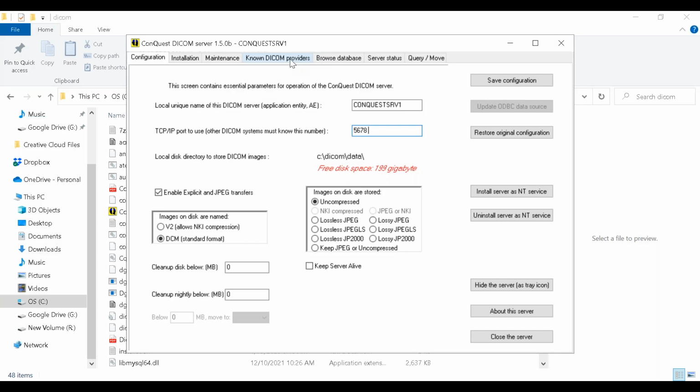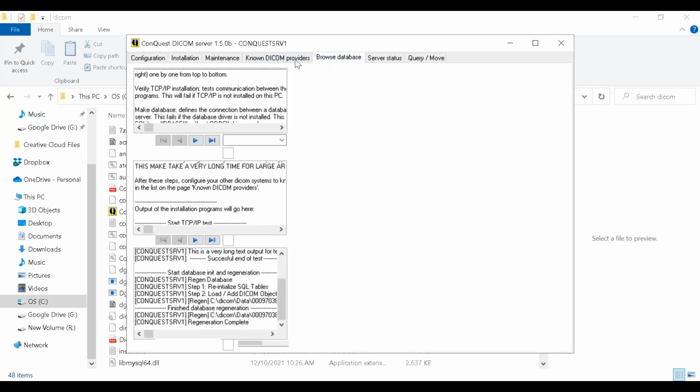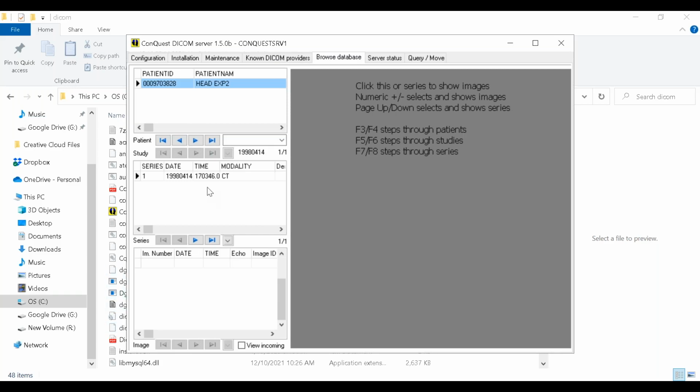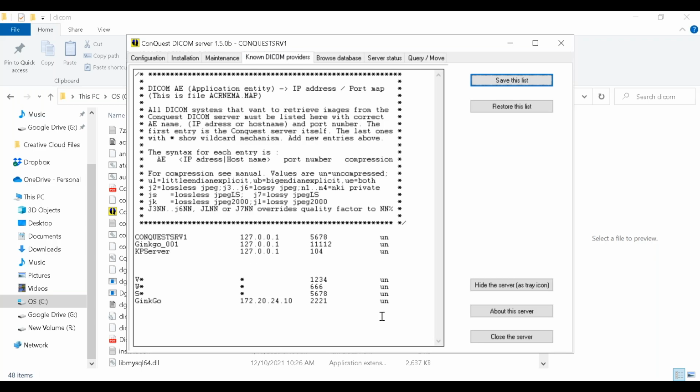So anyway, what I'm going to tell you is this. We've installed our software. We've installed it as a service. We've verified all of the setups. We've verified there's something in the database. There is something in the database, right? We've verified that we've got the client software set up. Let's do it on the client software.